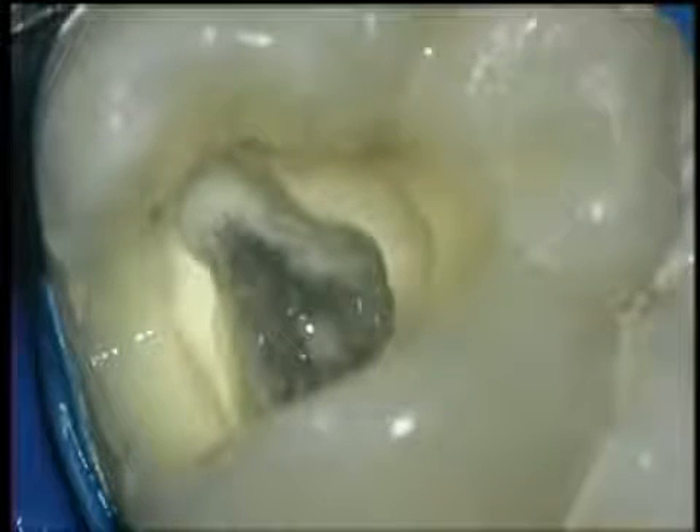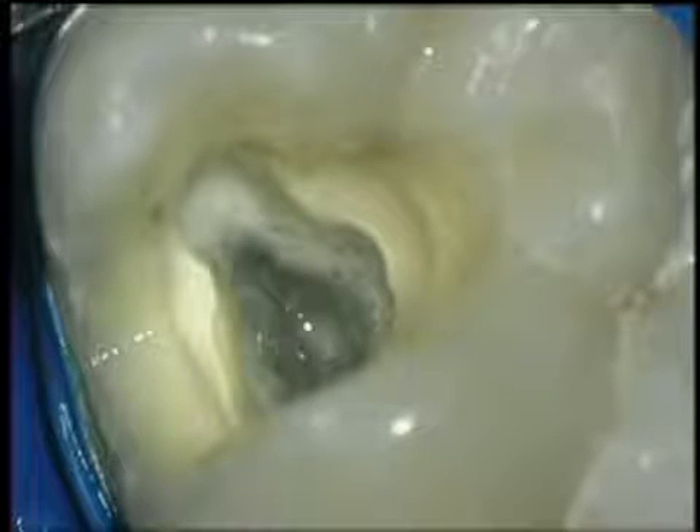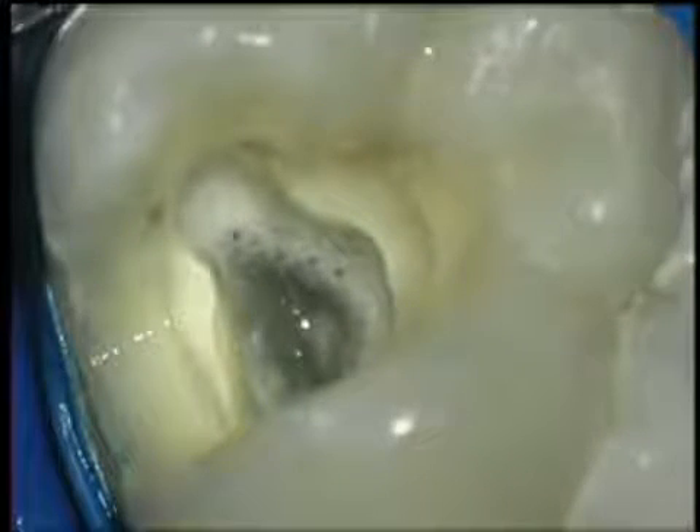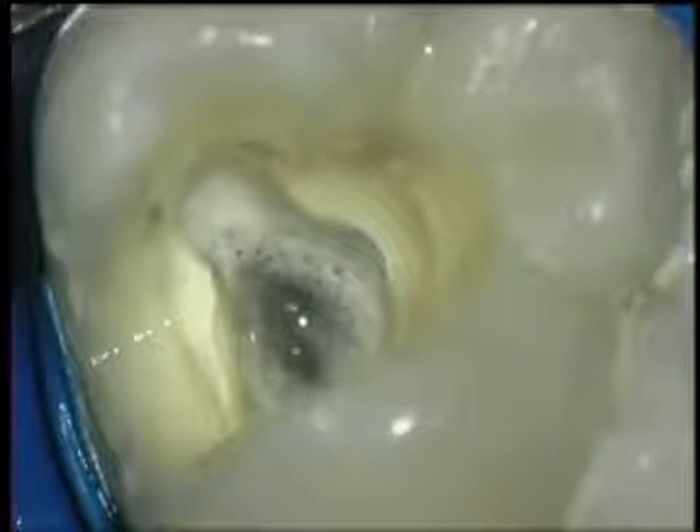Here is a look at the ProTaper instruments at work in a lower molar. Though there are four canals in this tooth, we've edited this procedure to focus on the mesial buccal canal. The ProTaper instruments should always be used in a wet canal space. Every endodontic case begins with proper access — a straight line to the canal openings is essential. Start with a number 10 hand file; it will alert you to any calcification or cervical curves not apparent in your pre-op radiograph. Gently work the hand file a few millimeters short of your estimated working length, then follow with a number 15 hand file.